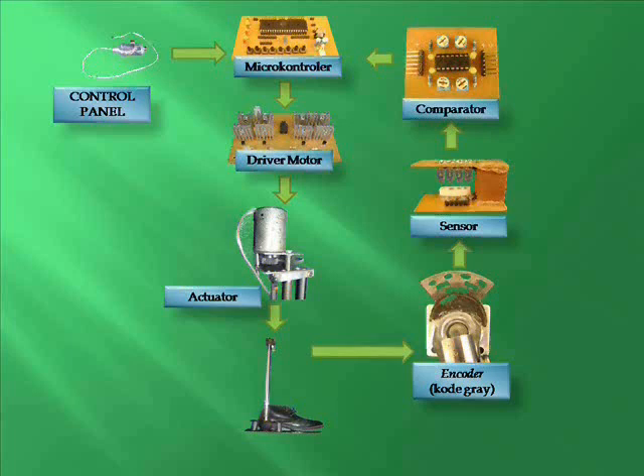The sensor has the function to detect positions and angles from the legs, so that we can calculate the speed and distance. The microcontroller has the function to process the output signal from sensors, so that we have results that can be used to control the motor movement.